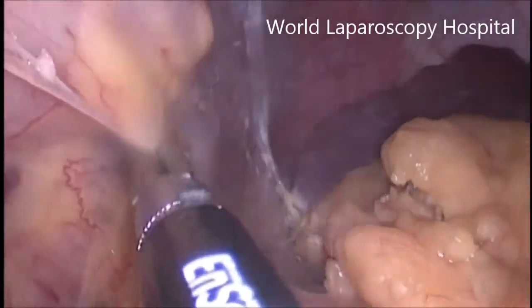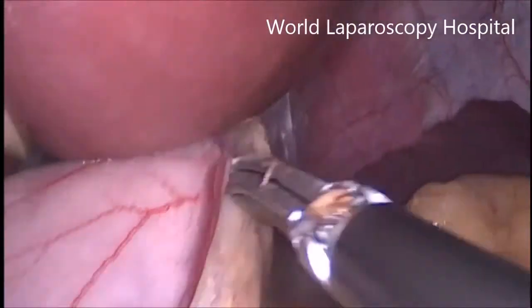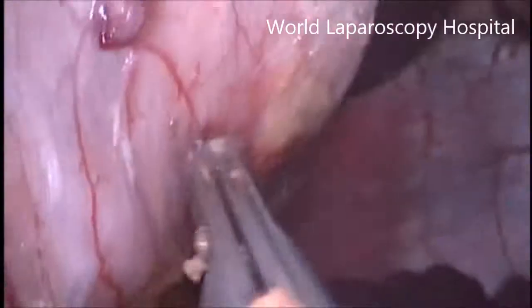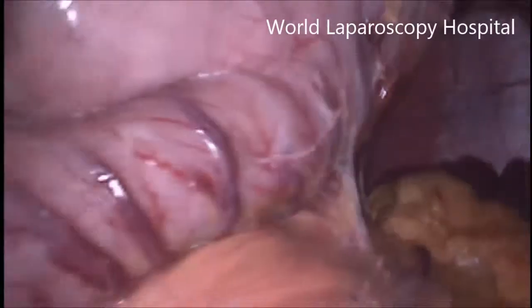Now you can see it is completely dissected. And here this is the diaphragm, this is the left crus which is visible. It should be completely fat free. There should not be any portion of fat attached.